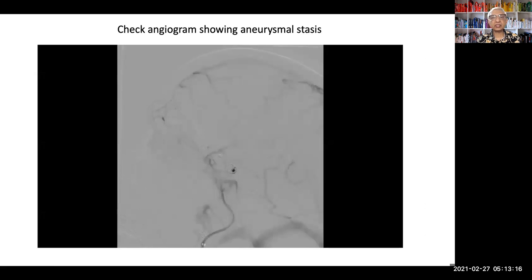So in conclusion, this is a very challenging case by every standard. One, of course, you have a ruptured aneurysm. We are not sure which is the one that ruptured, an extremely small aneurysm, or the large one. One needs a flow diverter. That would mean the patient needs antiplatelets. The other one is so small that you have to be careful that you do not rupture it. So we decided to do one without any antiplatelets, then load the antiplatelets, go over to the opposite side and do that second half after 2 hours.